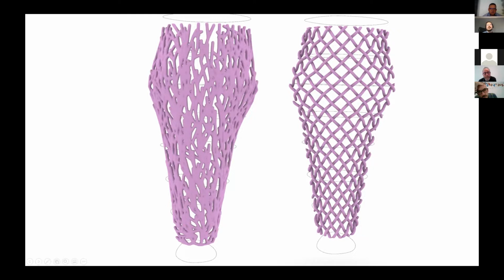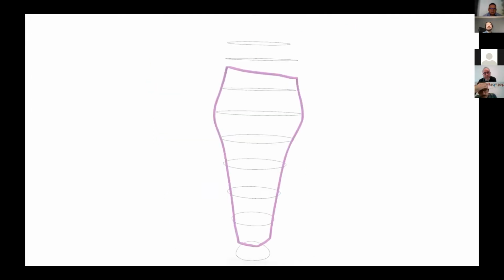So we have, instead of pixels, voxels that represent where there should be material or shouldn't be material in 3 dimensions. And using this approach opens up for creating more complex shapes and using some rather interesting pattern generation technologies like venations or knitting, or in this case, actually using a growth algorithm that will try to expand the line that you see here onto the surface.